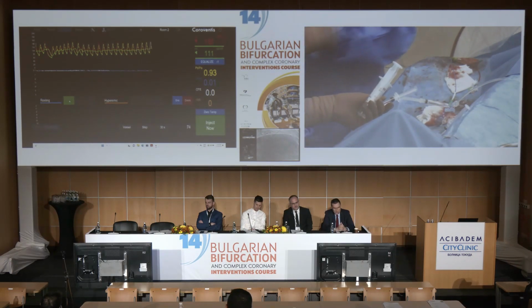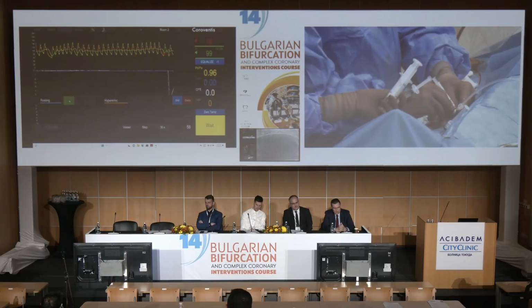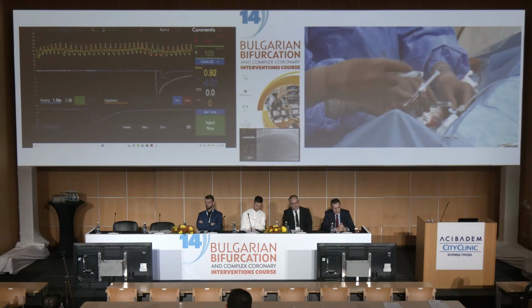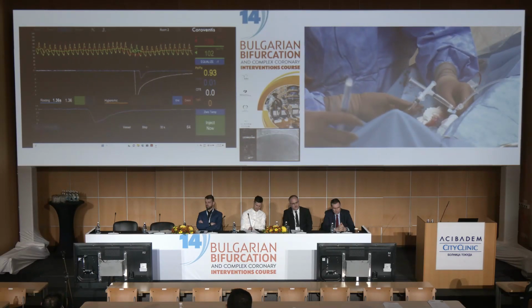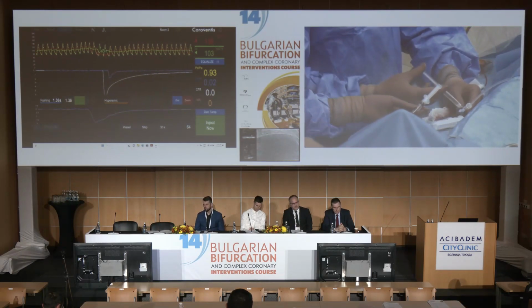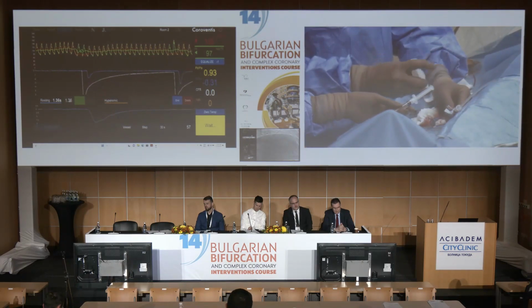Okay, whenever you want. We are ready to inject at rest, and Valérie is going to do that. And you see that the thermodilution curve, which appears here, is already much broader than what we have seen. It's relatively similar. Inject now, yes? Okay, that is one. That is a second one.